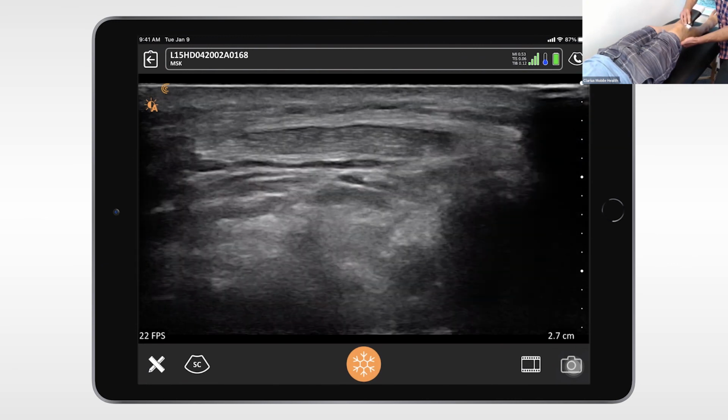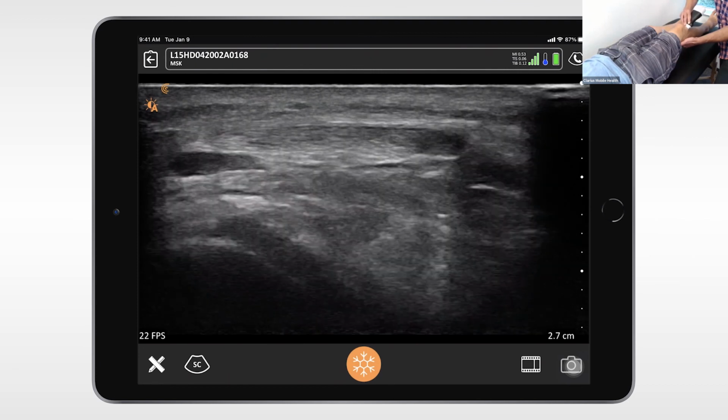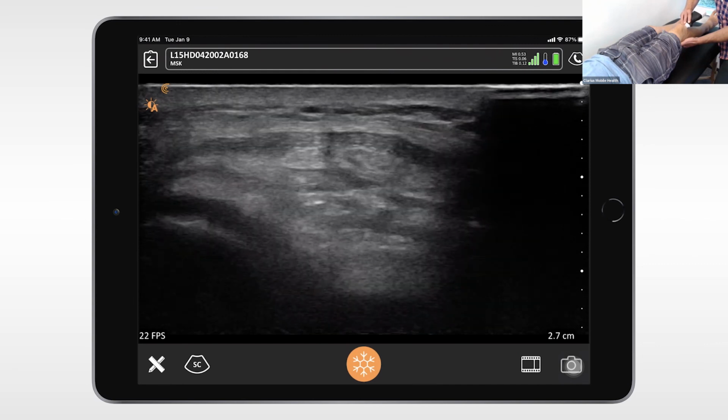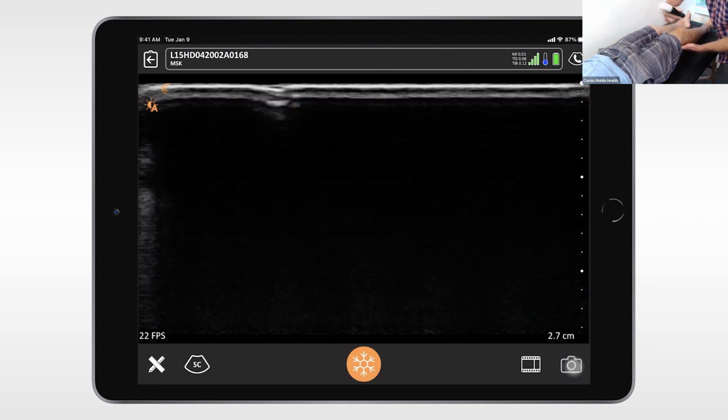Great. And this is what you said was really important, to assess the posterior aspect of that patellar tendon as the primary source of pathology. Great. Yes. Great. Yeah. What a powerful tool. Well, thanks so much for leading me through that. That's great. Yeah.